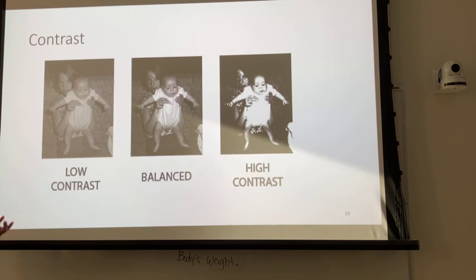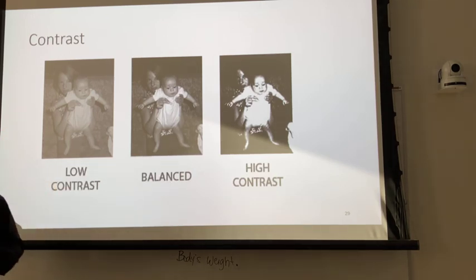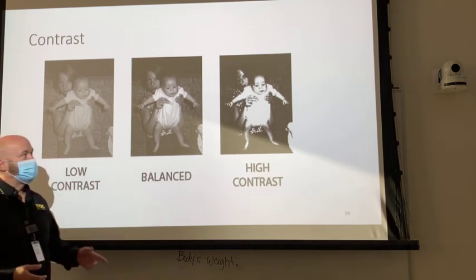But what are we looking for? Are we looking for ribs in a chest X-ray? No, so we want to see on top of those ribs or behind them, depending on if we're looking at anterior or posterior ribs. We want to see the lung markings, right? So we have to have a lower contrast as opposed to a ribs series. We want to see higher contrast.